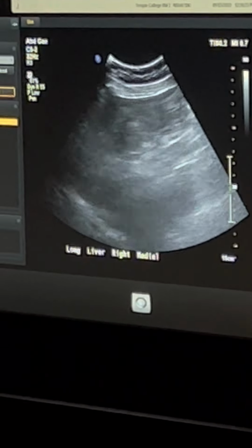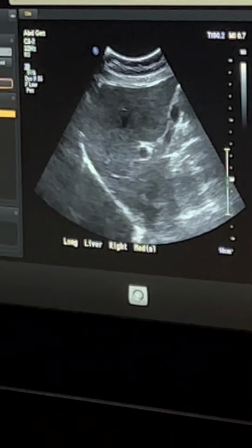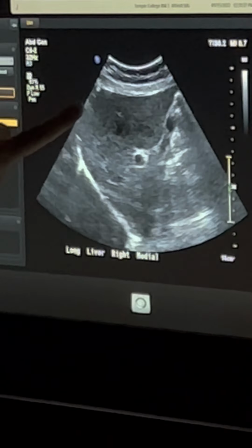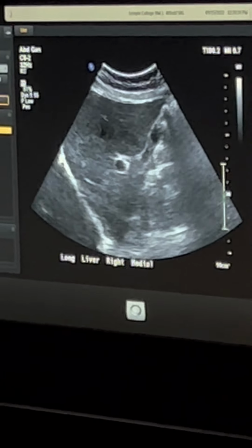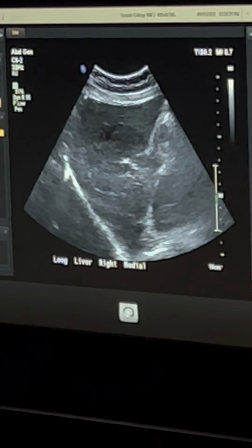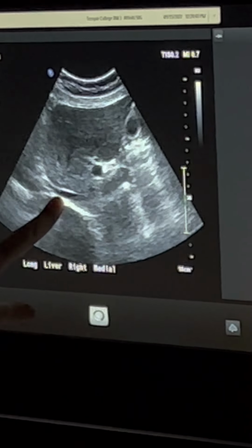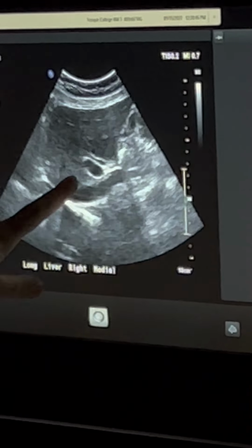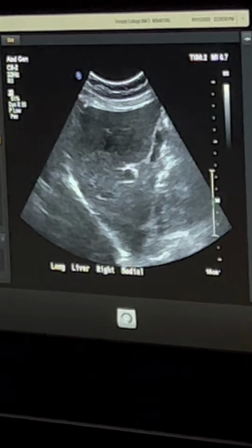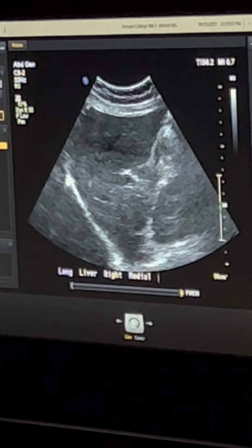Deep breath. So when I get here, I'm gonna see how I kind of scooted down to show all of these edges. I don't want that. I don't want that. If you have to take two pictures, take two pictures. But here is where it's gonna be. Now, if I go too far medial, what am I getting into now? Left lobe. So that IVC is your landmark of, hey, you've gone too far. Breathe. Okay?